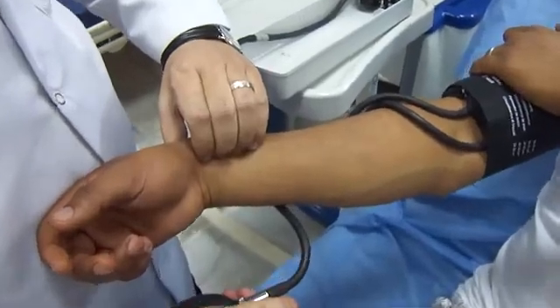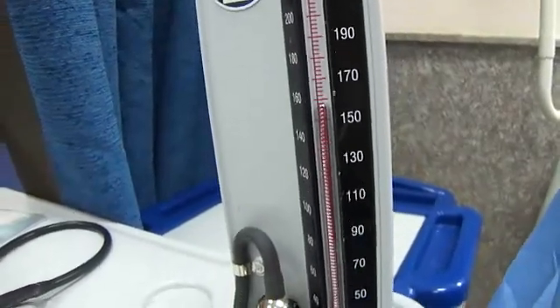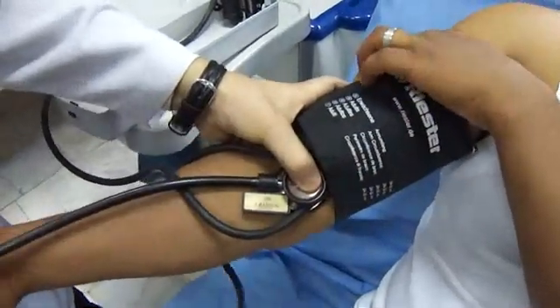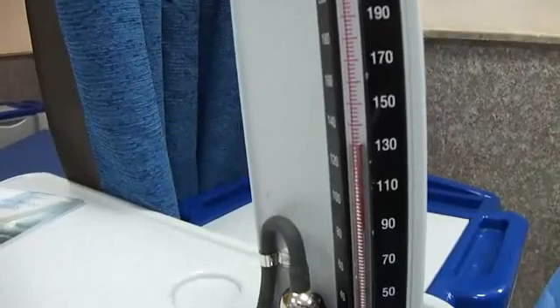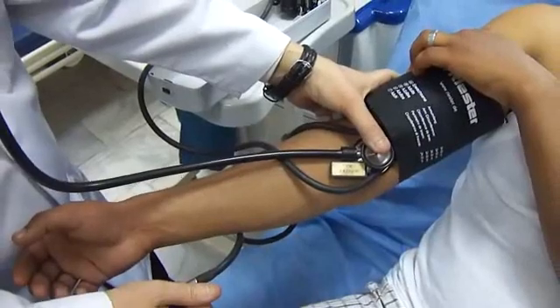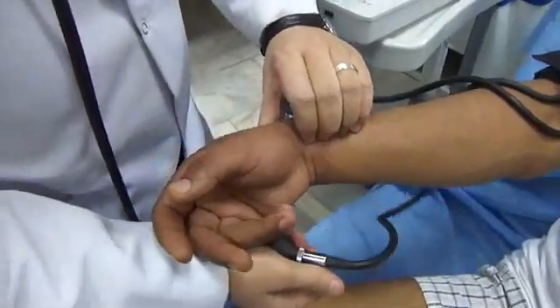Now the radial pulse has become impalpable. I'll raise the column about 30 millimeters of mercury further, then place the stethoscope over the right brachial artery and slowly deflate at 2 millimeters of mercury each time until I get the first Korotkoff sound. To ensure this is truly the first Korotkoff sound with no auscultatory gap, I'll also check the radial pulse, which should now be palpable.